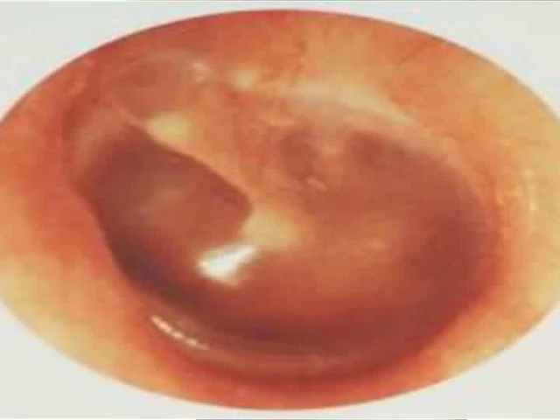Now the light reflex on the tympanic membrane of the left ear will be in the 7 o'clock position. The light reflex is the reflection of the otoscope light on the tympanic membrane. If it's the left ear, it will be in the 7 o'clock position. If it's the right ear, the light reflex will be in the 5 o'clock position.